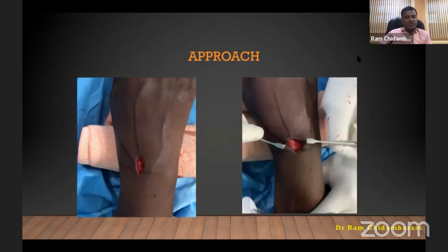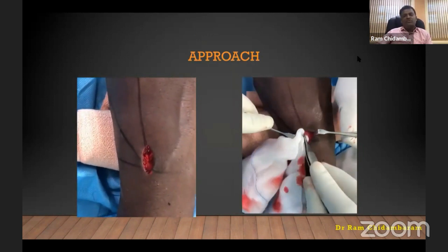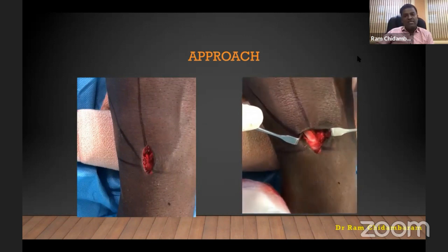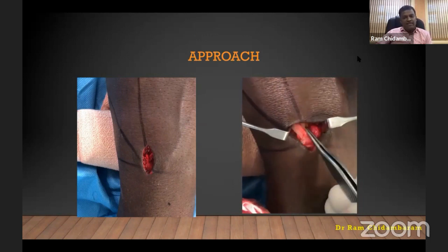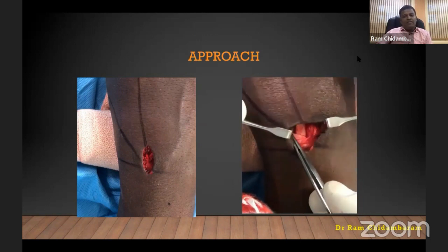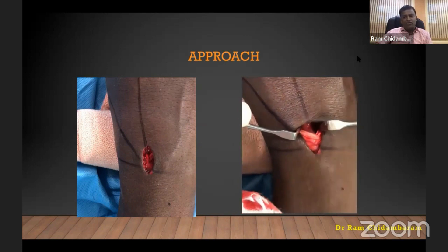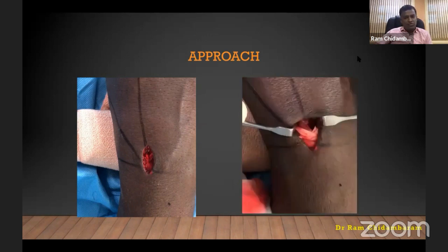This is the surface marking. I made a slightly longer incision because I want to see the extensor tendon and use wires for joystick reduction of the displaced fragments. The EPL tendon — third compartment — is retracted laterally, and the fourth compartment tendons are retracted the other way. You will see the capsule; make a small longitudinal nick in the capsule.